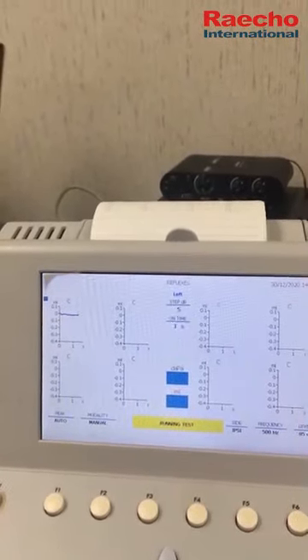So now you went from your steps 85 all the way up to 100. If you want to do it again, just to do validity, you hit start stop again.